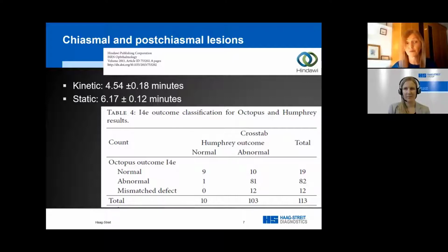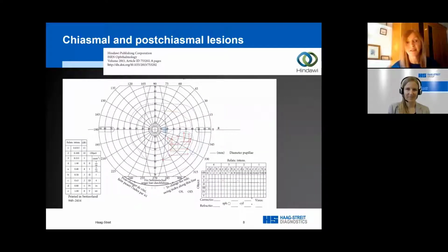And it is important in neurological conditions, just as for ocular conditions, that we consider functional vision. What we mean by functional vision is the entire visual system of the eye, the visual pathway, and the brain working together. And we need to know about this for daily life activities such as mobility and navigation. And because of that, we need to know about the peripheral field and not just what is happening in the central field. If you move to the next slide, please, Monica.